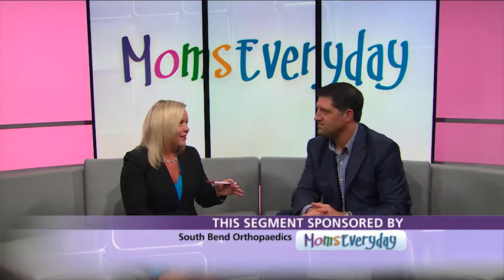Okay. So we do a CAT scan ahead of time, we get 3D imaging, and we get to factor in alignment from hip to the ankle for a knee replacement. Yeah. It just makes everything more precise. Very cool. It's really cool. It's a robotic arm that you use as a tool. Can you explain a little bit more about how it works?